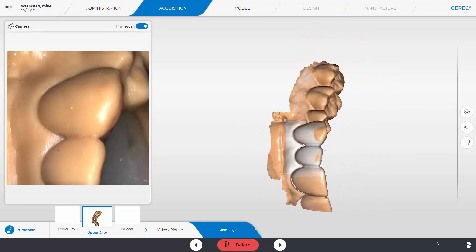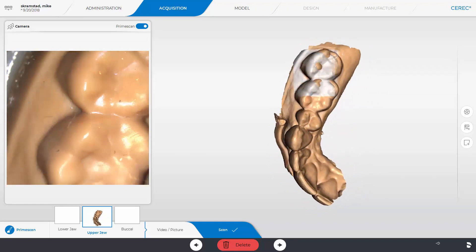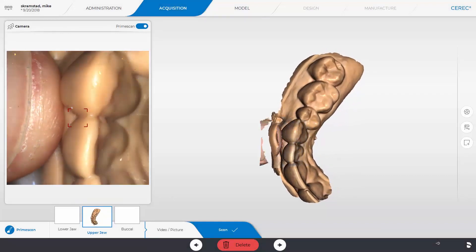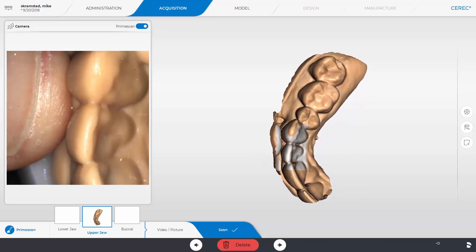Now as I quickly finish scanning this model, you'll watch me go ahead and try to scan my thumb and the software will not even let you scan it. As I move towards the thumb, it cuts it away immediately. It knows it does not belong and will not let you scan it.